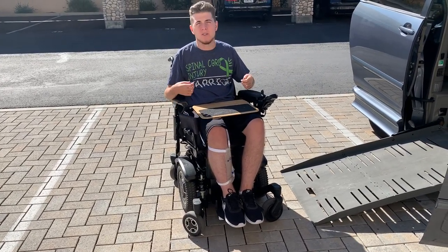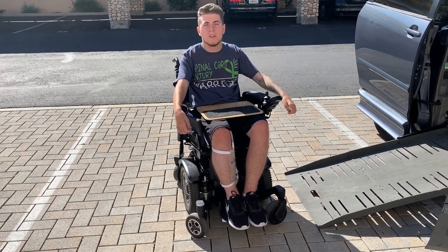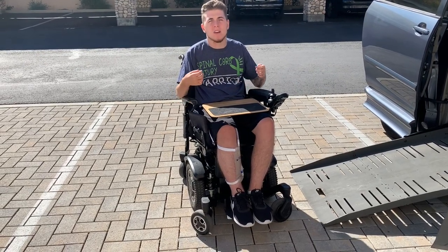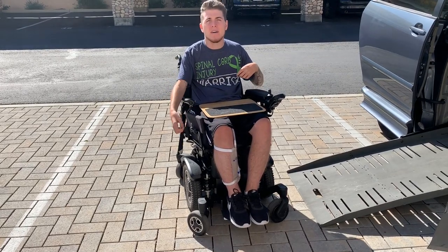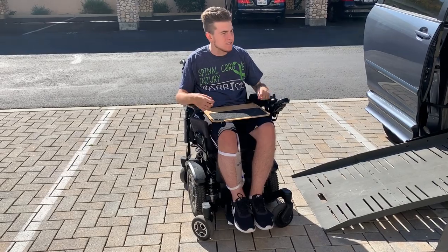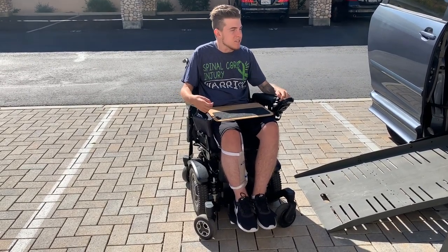I've been paralyzed for nine years, and up until now every time I got in a car I would use tie downs to lock my wheelchair down — two in the front and two in the back. Every time I got in the car someone would have to put them on and lock me down, and when I got out they would have to take them off. It was just a really long process.